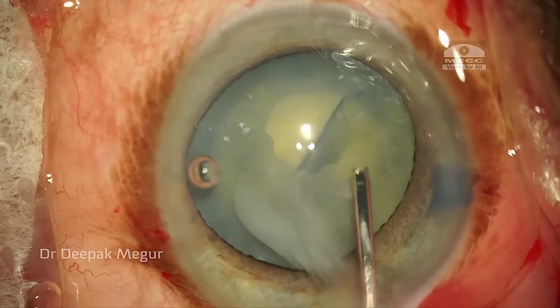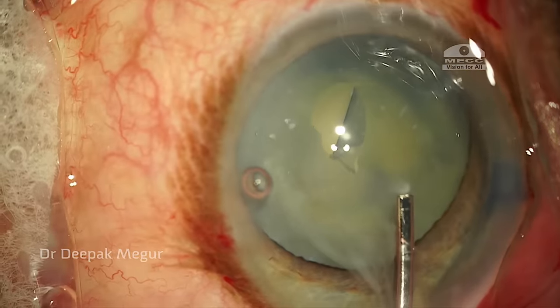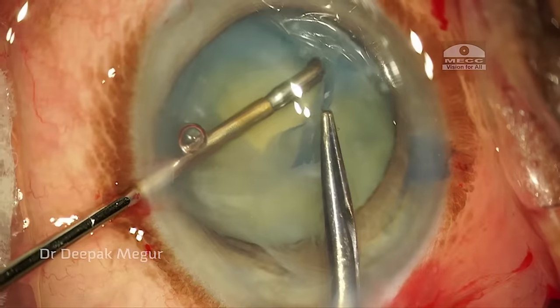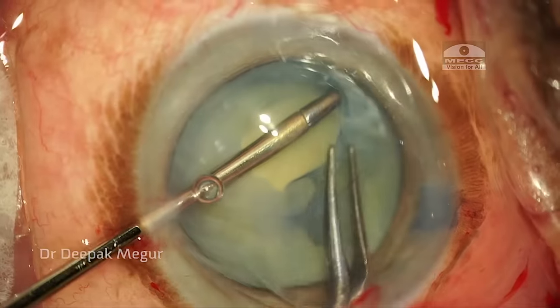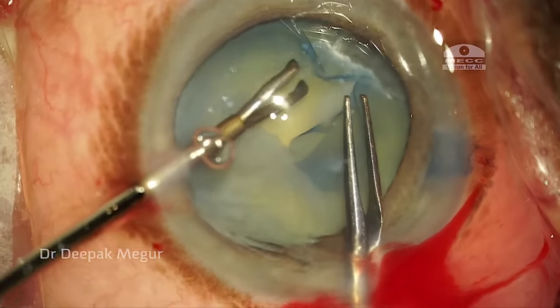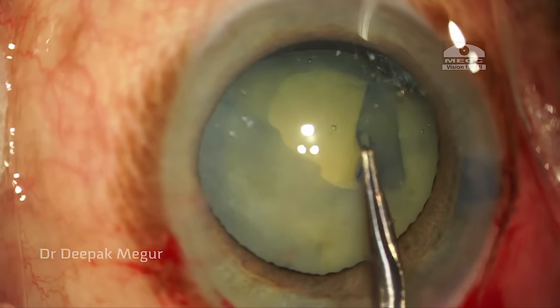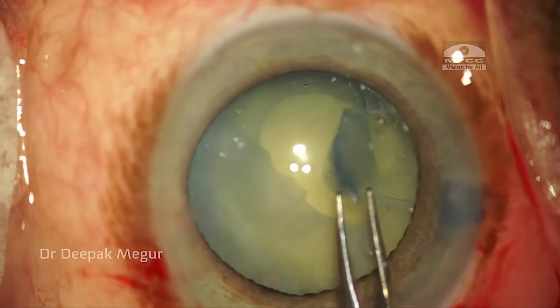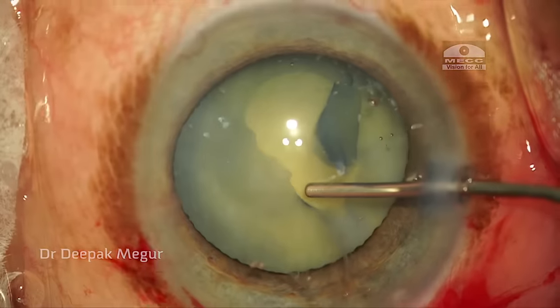I go back and flatten the anterior capsule by using OVD over it. To provide some counter-traction, my plan is to hold the other end of the capsule with the micro forceps and try to tear — but again this strategy also does not work. The bag is really flimsy and very weak; it can't really support. So I go from the other end and try to complete the rhexis, but again as soon as I reach the area of zonular dehiscence, the capsule refuses to tear.